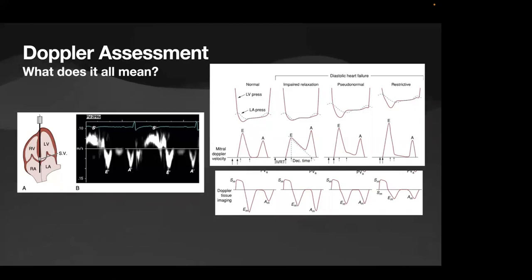And it's important, the position is important. Putting that sample volume in the septum will likely round out your E prime, so it'll become less apparent as to what their maximum E prime velocities are. And if you put it too close to the leaflets, you'll see some noise. And if you change your gains, you'll see some over or under damping. So it's an important aspect.